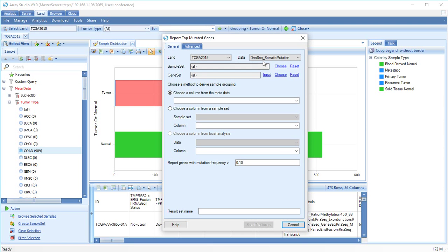We will look for DNA-seq somatic mutations. These are mutations that were detected in a tumor sample, but not its matched normal sample from the same subject. You could also look for mutations evident in RNA-seq, or RNA-seq somatic mutation.